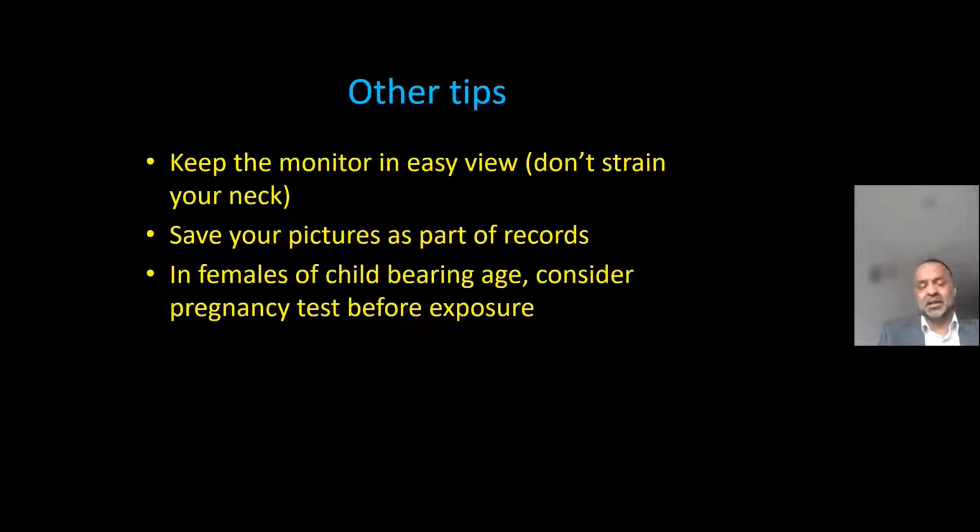When I see my colleagues who are laparoscopic surgeons, they usually have, not 100, but easily 5-6 monitors in the room. Some of our urology colleagues even have a monitor for the patient when they're doing the TUR, BT and these things, so that whatever their position is, they can find a monitor placed there for easy viewing. Unfortunately, C-arms don't have multiple monitors. The majority of modern C-arms will have 2 monitors, but they will be anchored to the same base. So make sure that it is in your easy view.